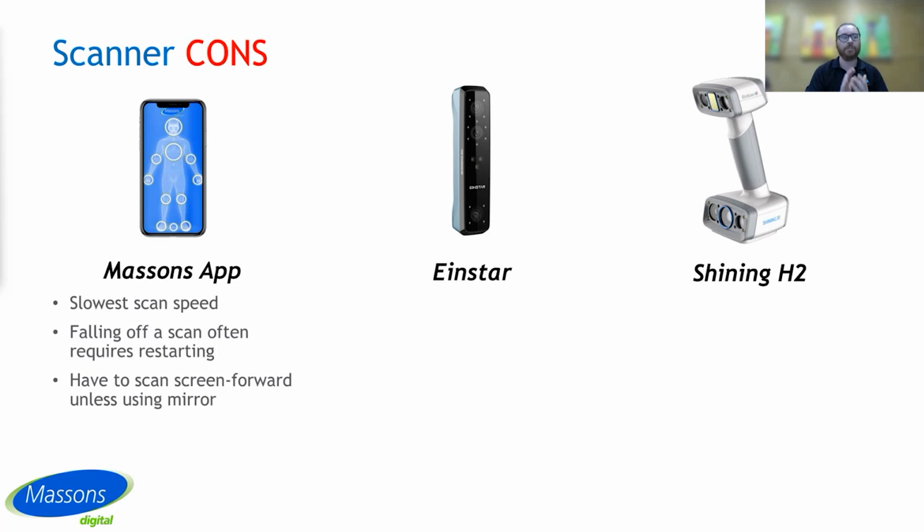You do have to scan screen forward unless you're using a mirror attachment, and this is just due to the cameras that are actually taking the scans being the ones that normally scan your face. So you need to use a mirror if you want to look at the screen, but I have met many clinicians now who've just perfected the art of holding their hand the right way. They know the distance around the shape and they can scan without even looking at the screen.